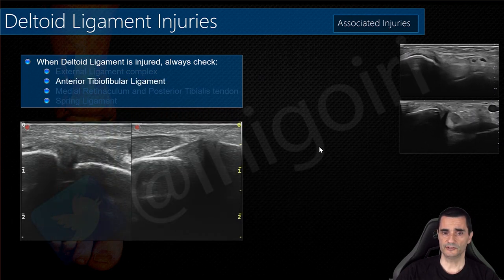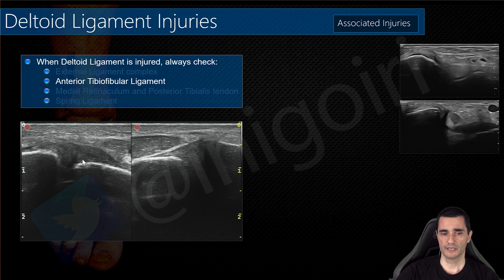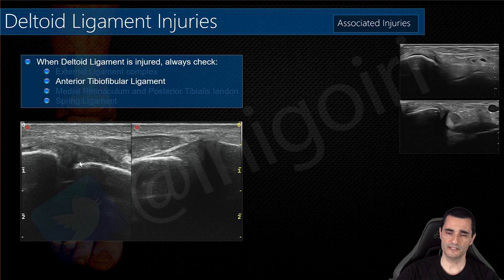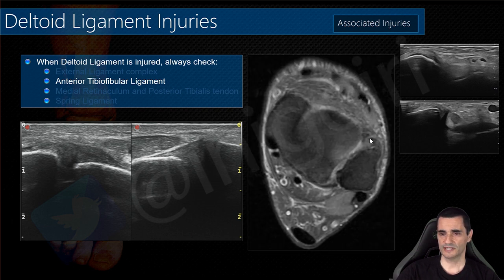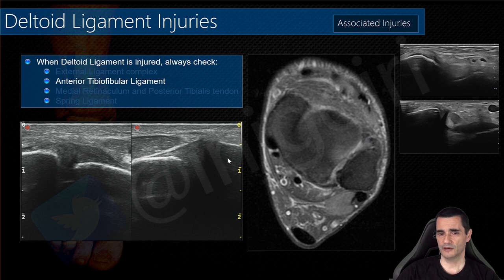The anterior tibiofibular ligament — in another patient with affection of this ligament: the normal side is shown, and the affected side appears thickened and hypoechoic with a partial rupture in depth. This ultrasound scan was performed in the subacute phase; in its acute phase the ligament appeared totally affected but is now partially repaired. This represents an affection of the syndesmosis.